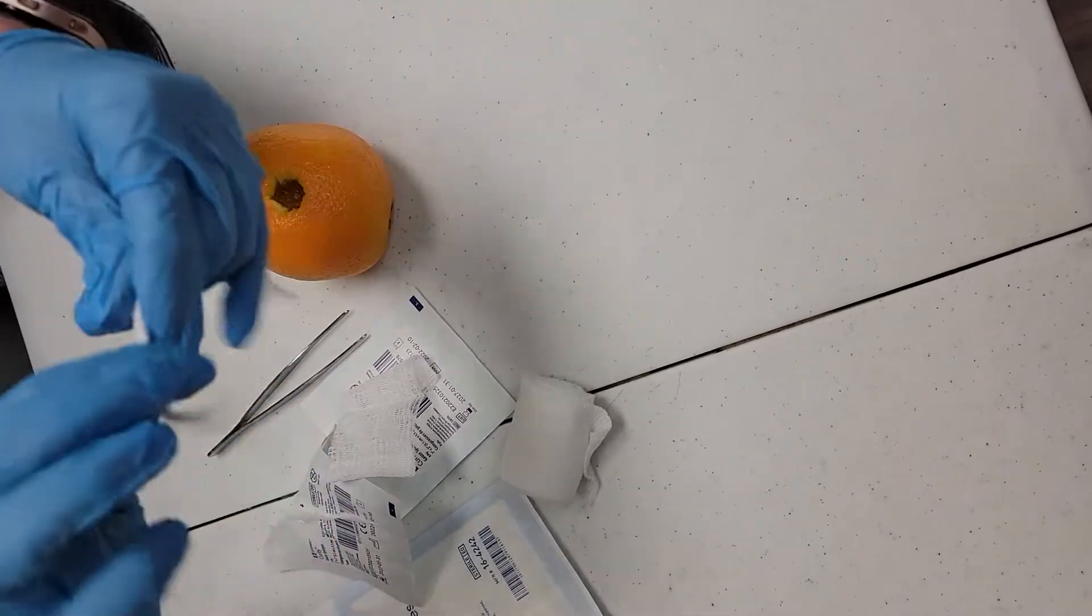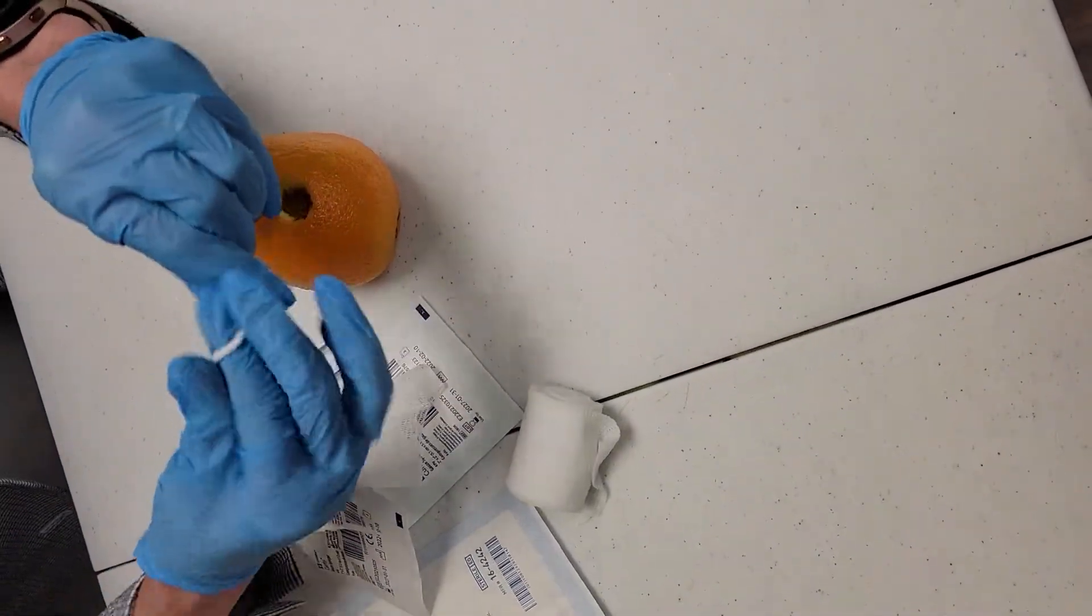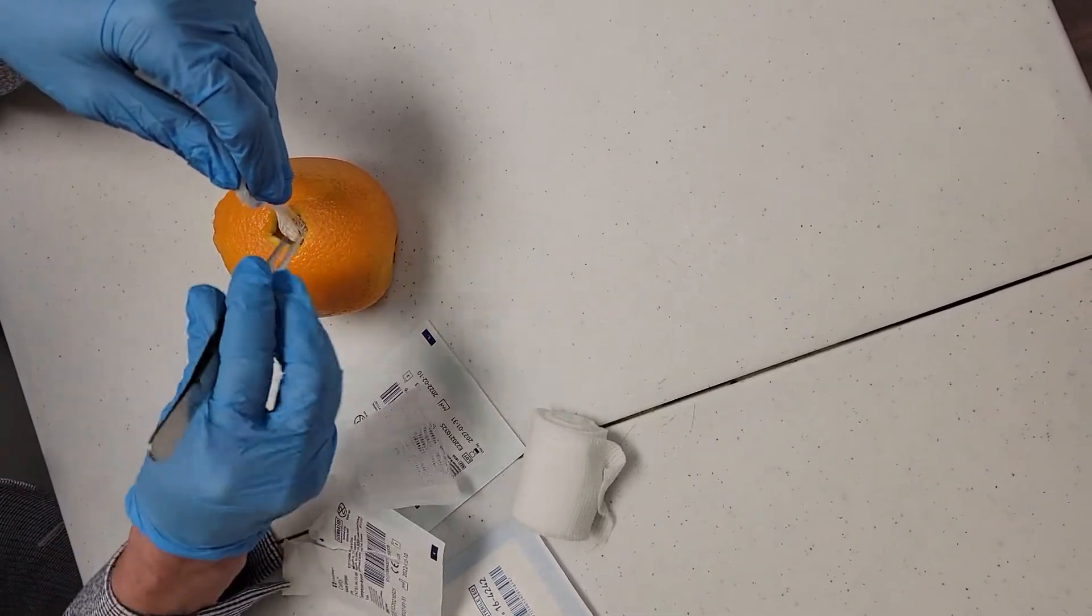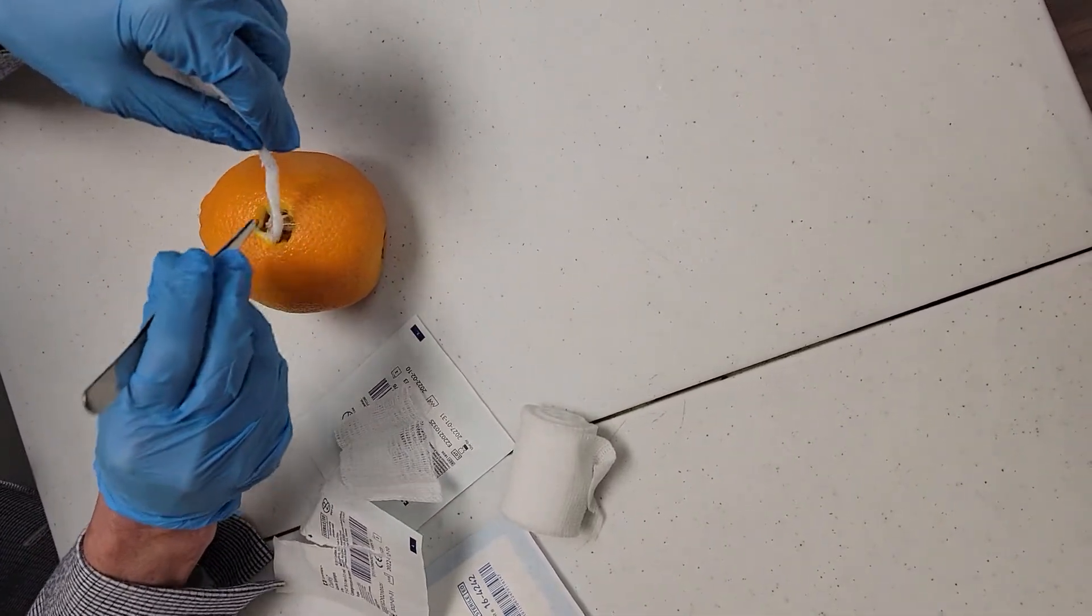And then really twist it, twist it up. And then what you're going to do is you're going to start feeding it in with your sterile forceps.